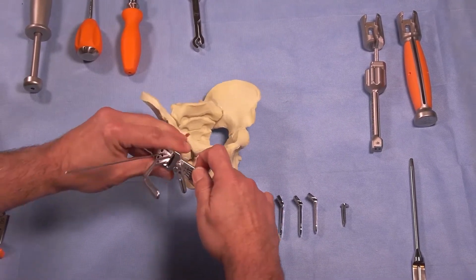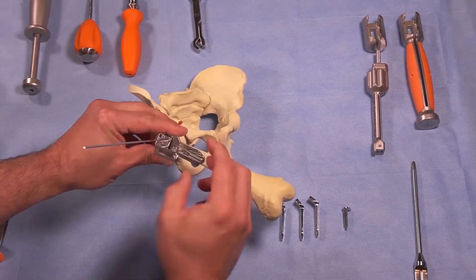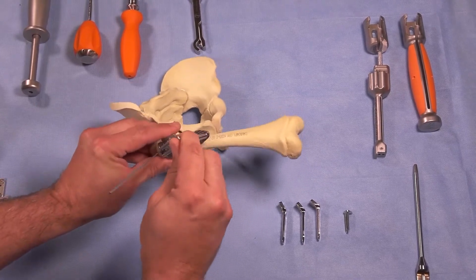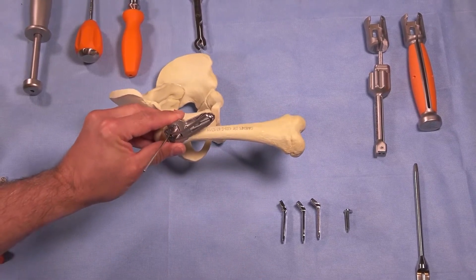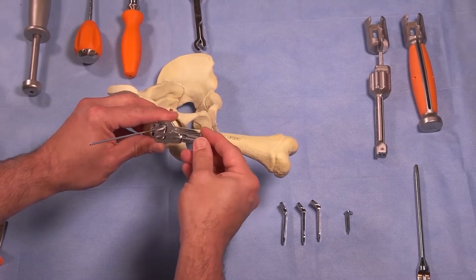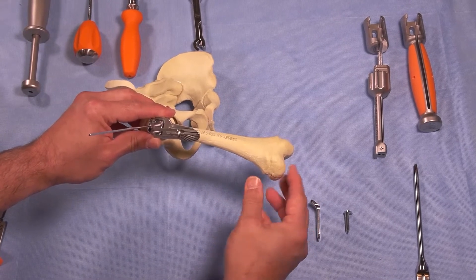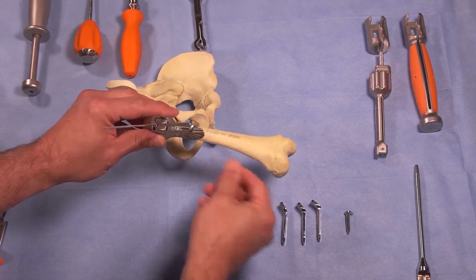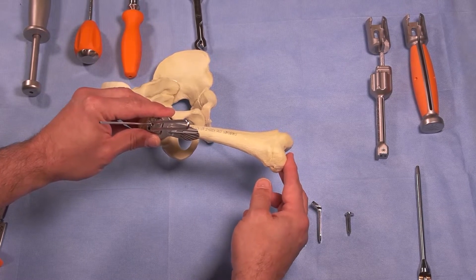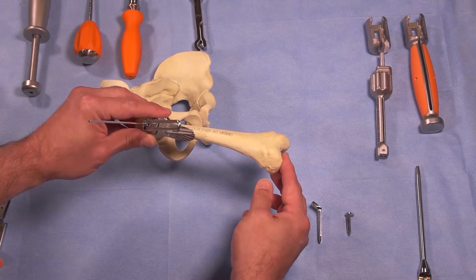This is the same as setting your chisel footprint to either induce extension or flexion. To quantify that, you use this gauge. If I align my dial to the long axis of the bone, that's going to give me 15 degrees of flexion.